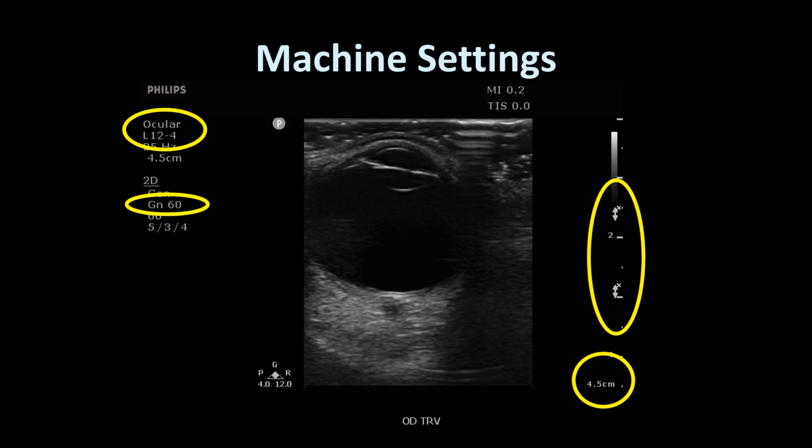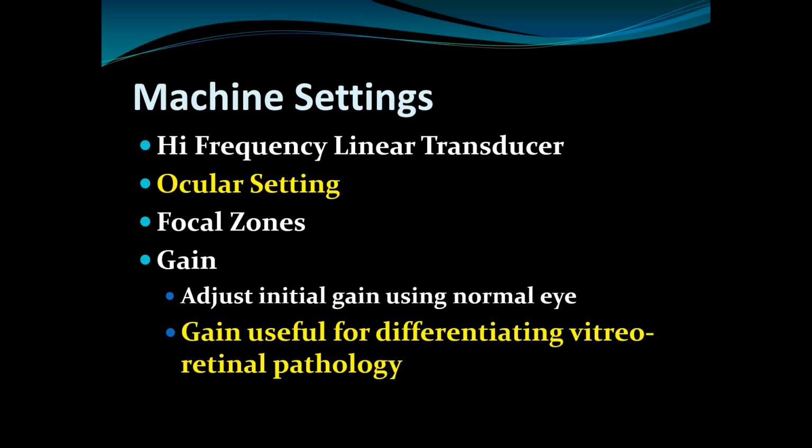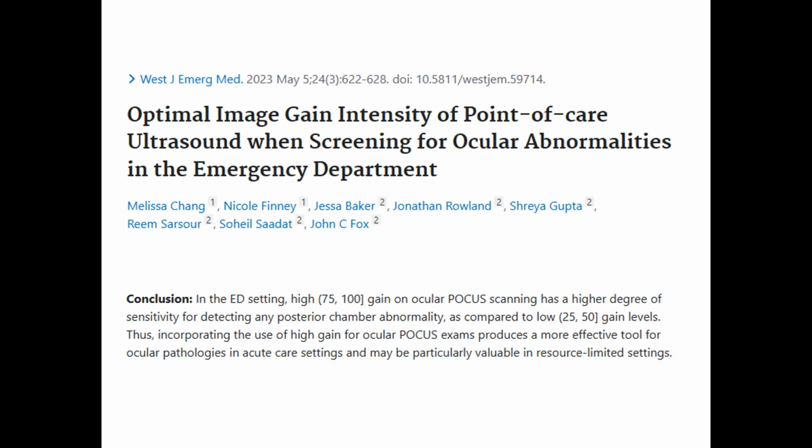And then gain. Now this is going to be somewhat variable because you'll find that some things you can see really well with a low gain, but other findings of pathology in the eye, you actually need a higher gain. So basically your ocular setting, and we'll talk about why in a minute, you want to make sure that you're using focal zones where you want them and then changing the gain during the exam. So there's actually an article just last year or 2 years ago looking at the optimal image gain intensity for point-of-care ultrasound. And they basically found that a higher gain was appropriate.